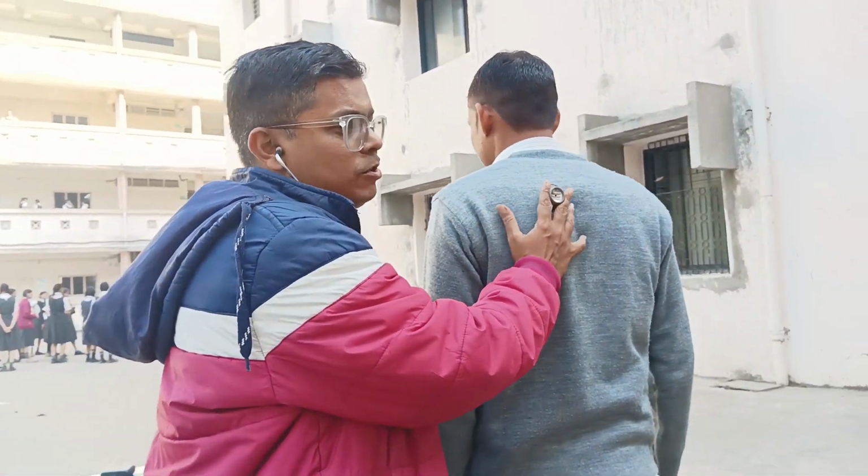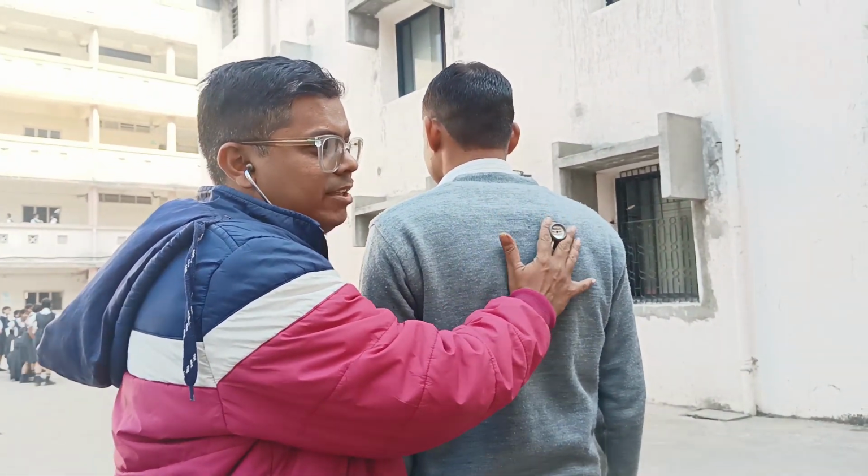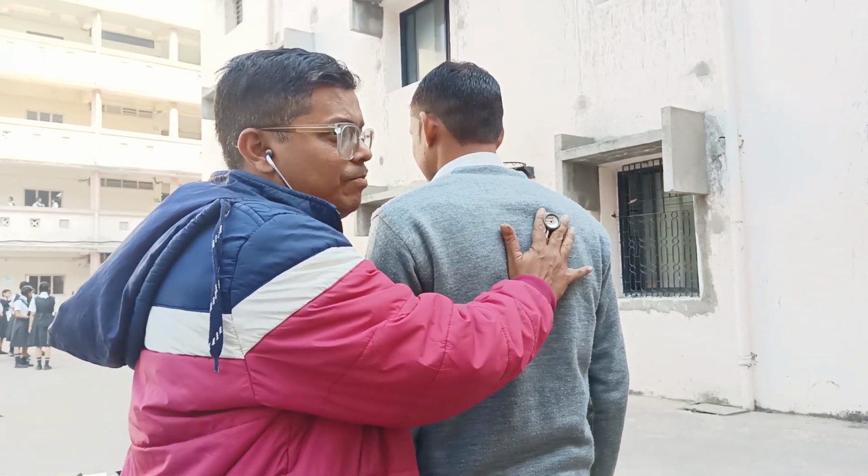Okay. You should know what the heartbeat of a healthy person is, and of the patient, and then compare, and then you come to know what problem is there in different parts of the body. Different ones are there. Okay. As well as from the back side, you can also know if someone is suffering from asthma or something like that. That also you can check.